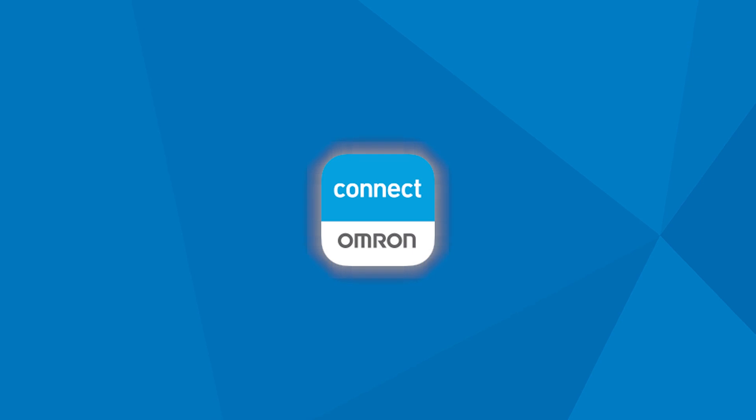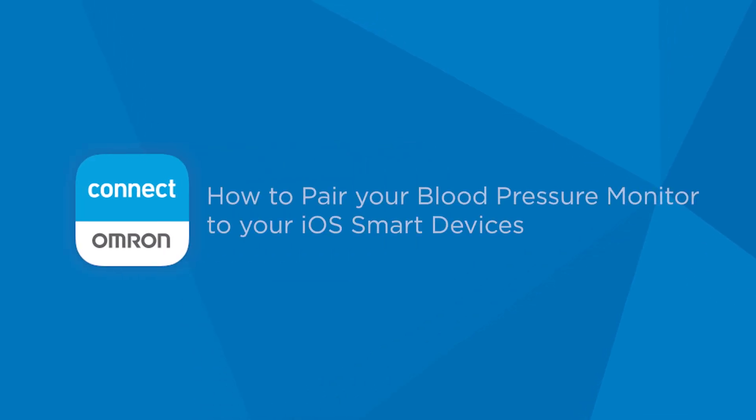Once you've downloaded the latest version of the Omron Connect app from the App Store, you'll need to unpair your blood pressure monitor from the Bluetooth settings on your iOS smart device. Here's how.